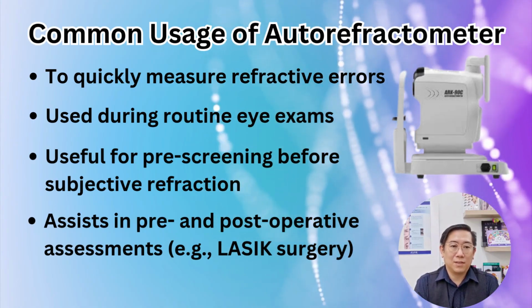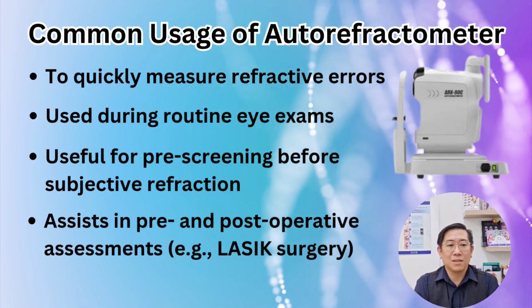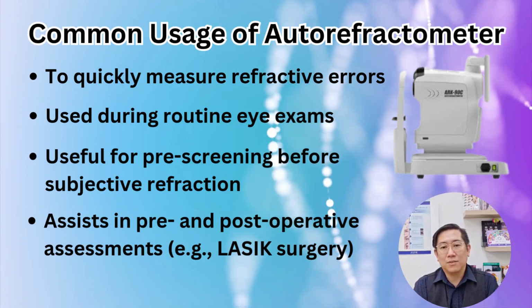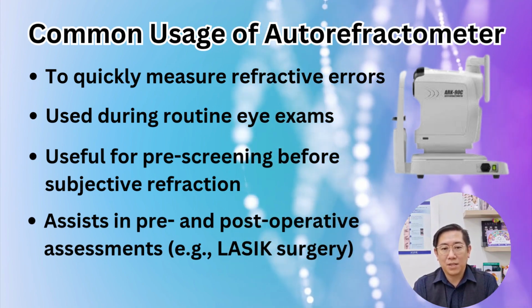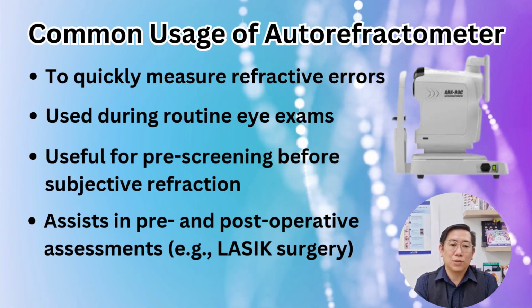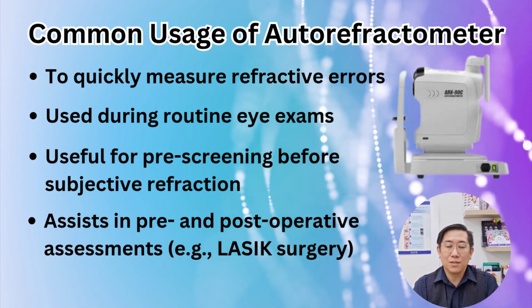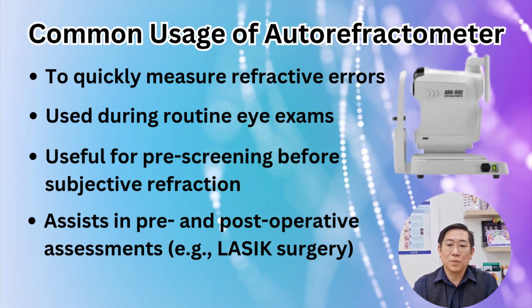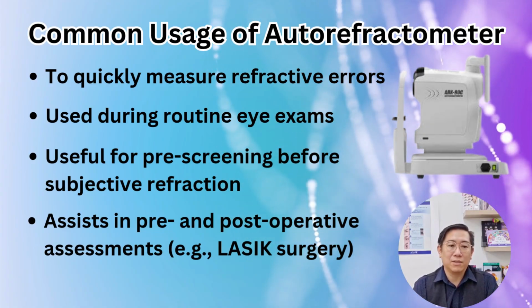Now let's talk about the benefits. The procedure is fast and efficient, usually completed in a few seconds. It is objective, meaning it doesn't depend on patients' verbal responses, which is especially helpful for young children and elderly patients or patients with communication difficulties. The device is also user-friendly, often featuring automated alignment and easy-to-read digital results. Some models are portable, making them suitable for community screenings, bedside use, or even outreach programs in rural areas.